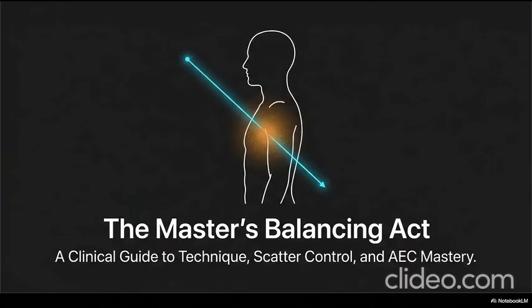Wow, okay. But they're still hitting the detector eventually, right? Just hitting it from the wrong direction. Yes, and that's the problem. The digital detector is trying to record a straight-line shadow of the internal anatomy. When scattered photons hit the detector from all these oblique random angles, they aren't carrying any useful anatomical information. They're just noise. Pure noise. They lay down a blanket of gray fog over the entire image, physically degrading the crisp contrast we just worked so hard to preserve with our kVp settings.